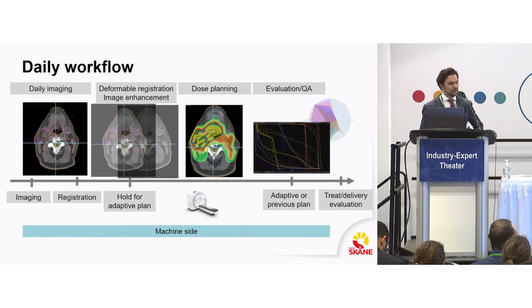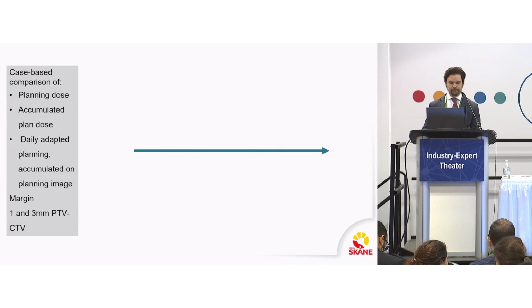So of course it's interesting on the time scale of this. I won't comment so much, simply because we did this work on a standalone PC, at an early stage of integration. But the process takes a few minutes. So it's not the optimization process that will significantly increase the treatment time in this process.